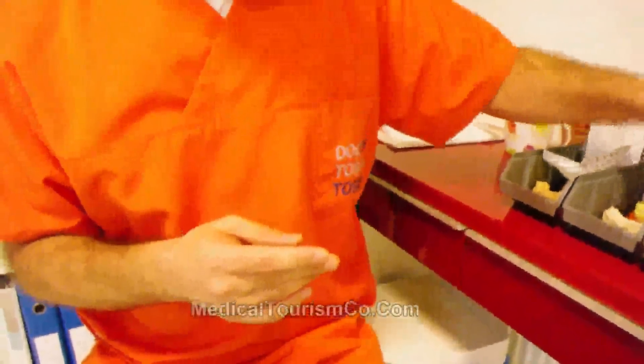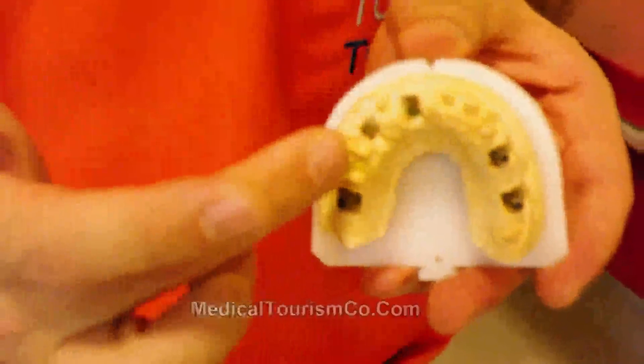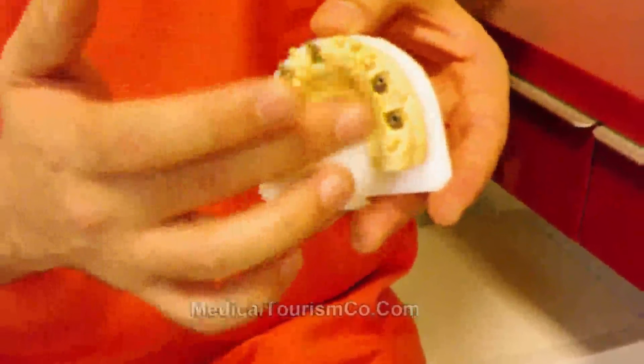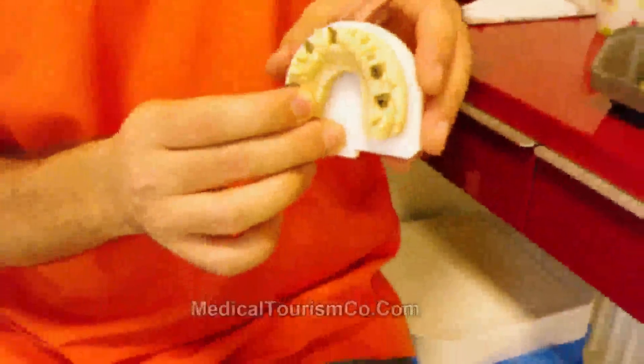In some cases we can combine implants with natural teeth, and in some edentulous cases we can construct the prosthesis only on top of implants. It depends on the patient's needs.